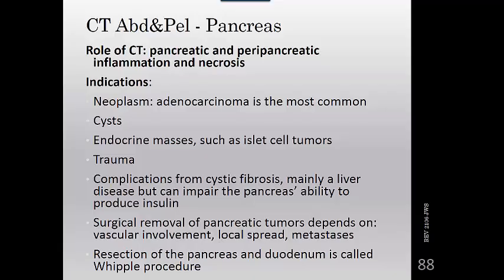And when initial scans fail to differentiate the margins of the pancreas from the duodenum, patients are often given an additional oral contrast material, and additional slices are obtained with the patient lying in the right decubitus position. This will cause the duodenum to drop and separate from the pancreas.